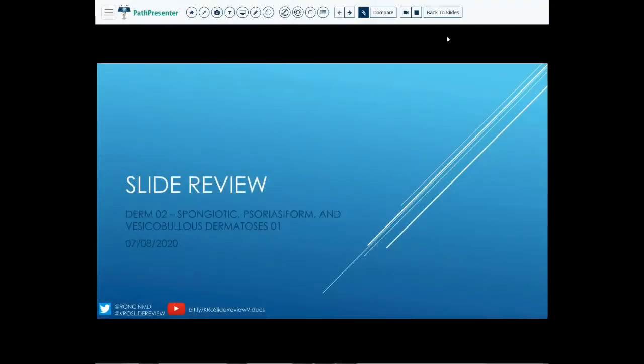So today we are going back to Derm 2, which is our Dermatoses lecture that we gave last week, and we are going to go over the challenge cases since this was something that there was some expressed interest in.